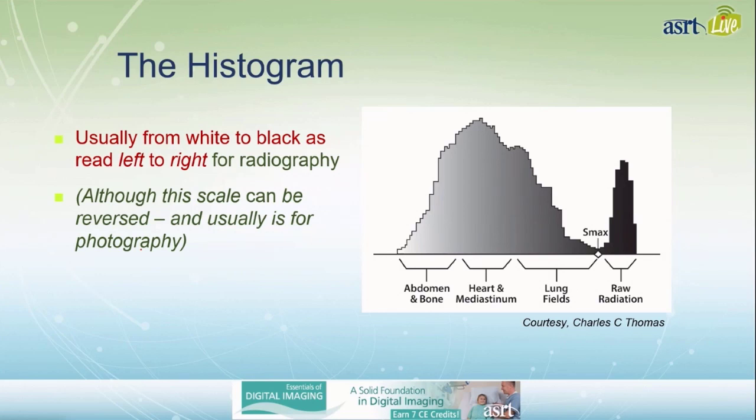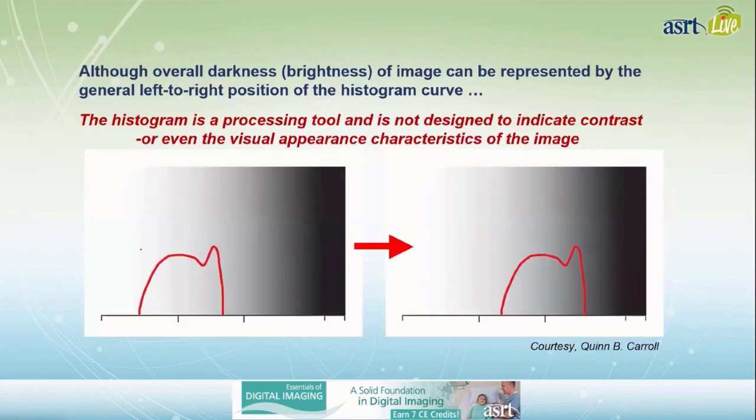The spike was on the left end, and they were also very long and kind of tortuous. And it took me a few moments to realize that those histograms were backwards. They were simply being presented as black to white, and they were being stretched out. So it took some getting used to. But if you are careful, the histogram interpretation is still the same. You just have to watch that it can be reversed in its presentation.